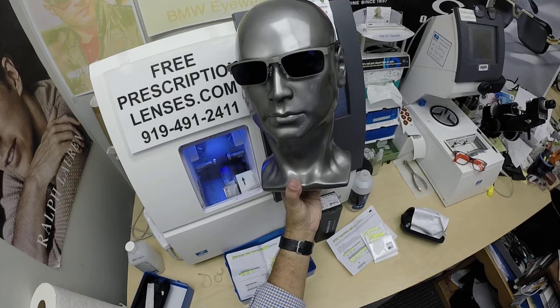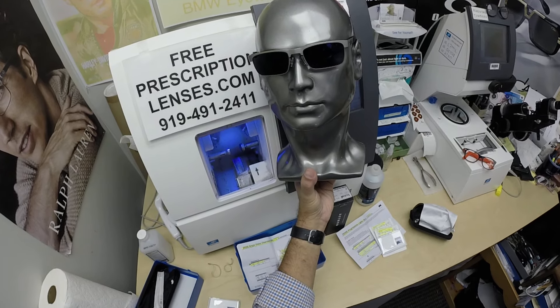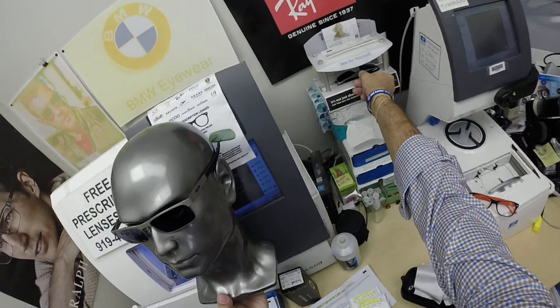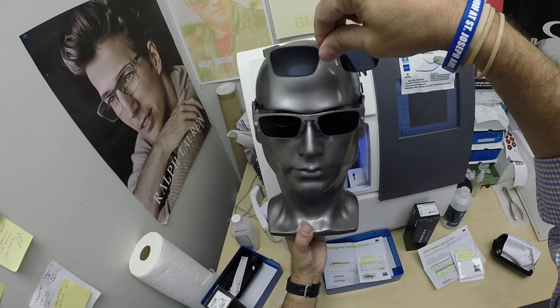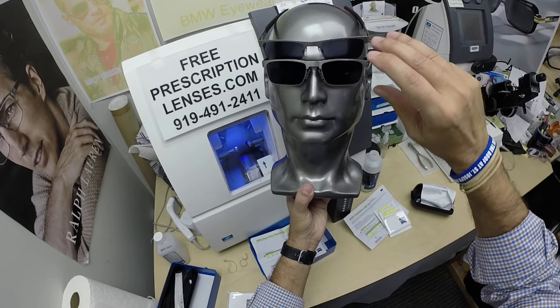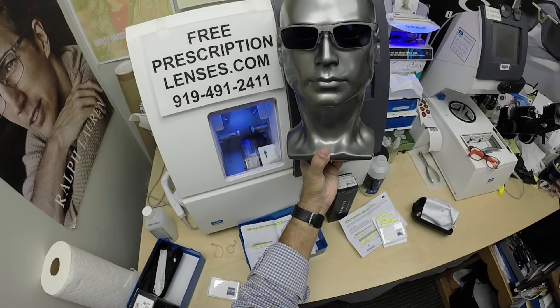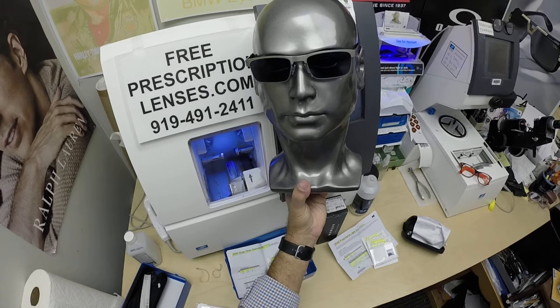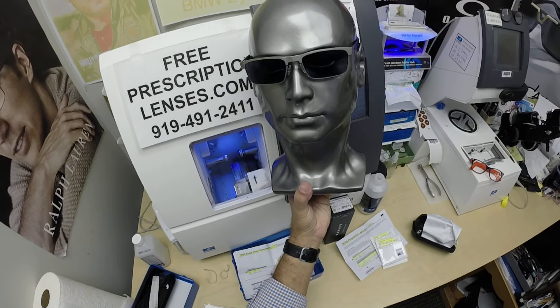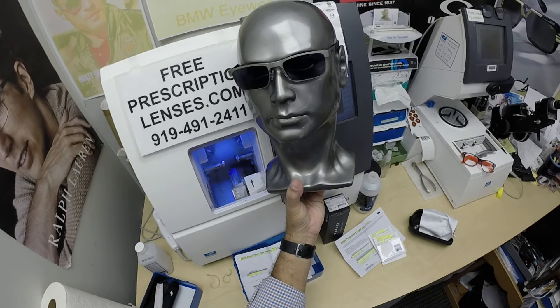These are the Zeiss PhotoFusion Extra Gray, which is designed to get darker in hotter weather, designed for extra active people who spend extra amounts of time outside. The other nice thing about photochromic lenses is they were the original blue light blocking lenses. Today's electronic devices — cell phones, tablets, computer screens — emit harmful blue light, though the study is still out on the effects of that. Still, there's no known cure for macular degeneration, so if it helps with that, it's worth the price of admission. These will block up to 50% of blue light indoors and over 95% outdoors, so you're going to get maximum protection.